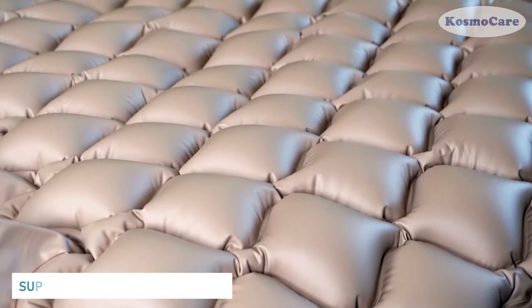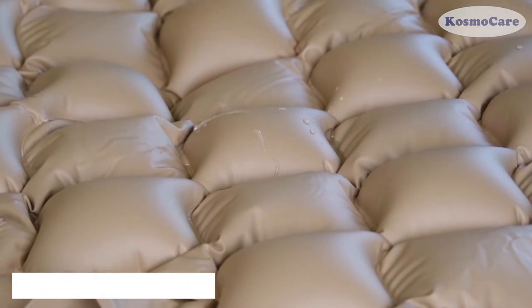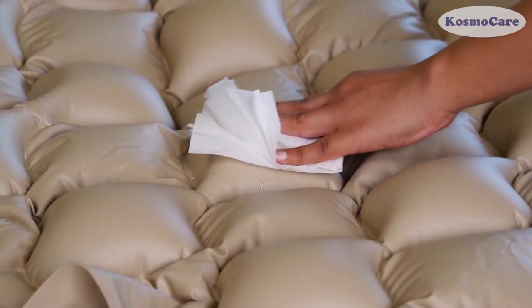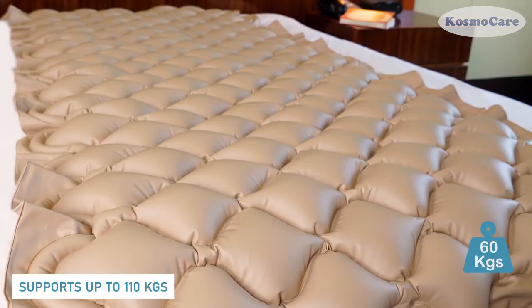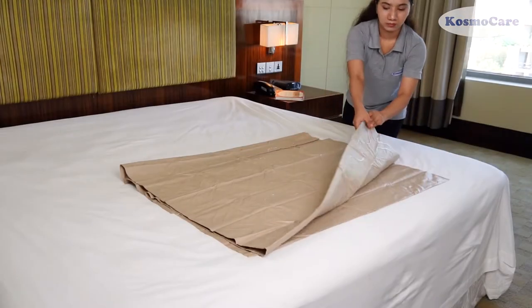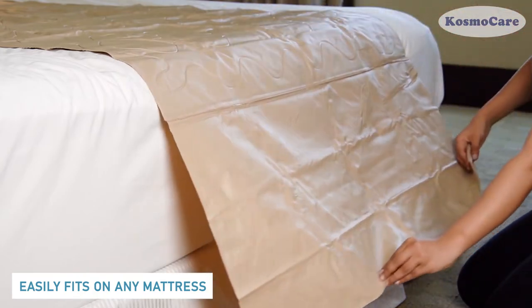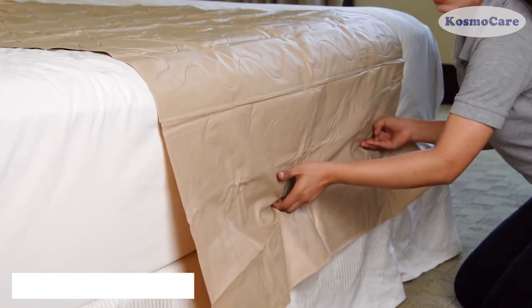The mattress is made with high-quality medical-grade PVC waterproof material with 0.3 mm thickness and is easy to clean. It can support up to 110 kg and easily fits on an existing mattress. Place the extension flap under the bed to ensure the mattress stays firmly in place.